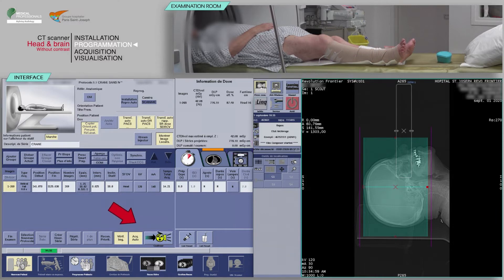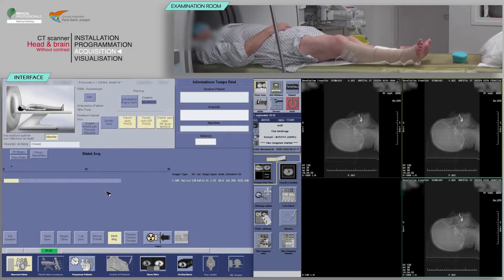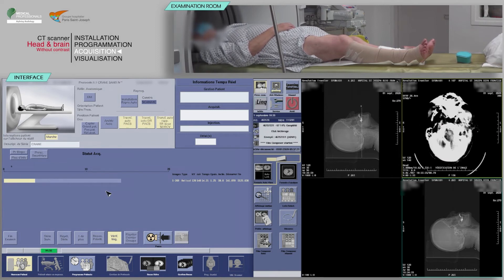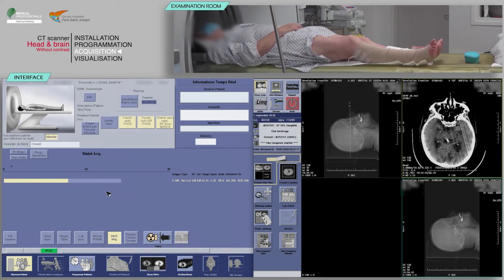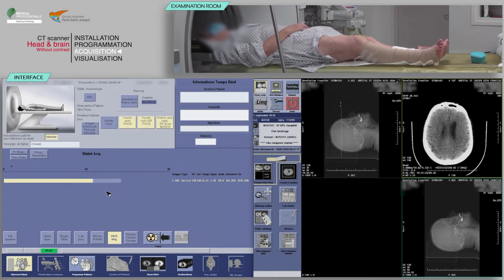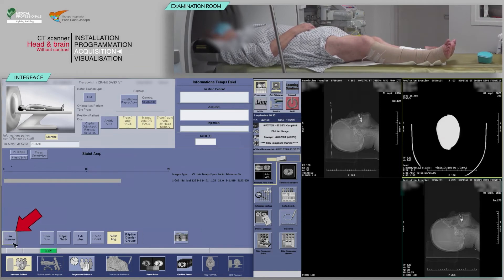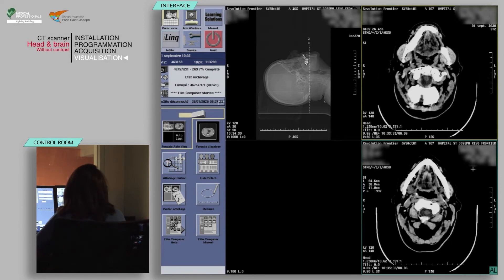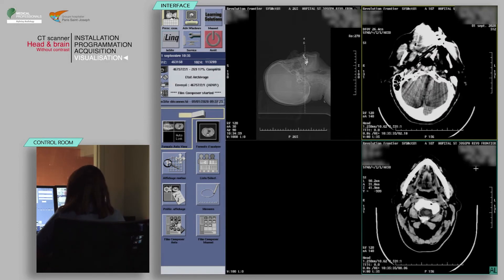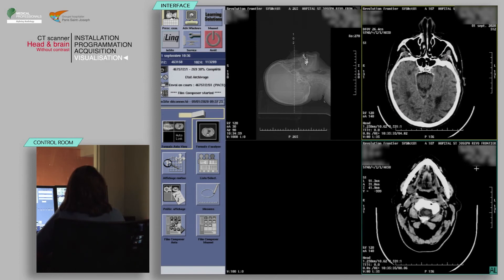Click Confirm. On the keyboard, move the table and proceed with the acquisition when the buttons are flashing. Verify the absence of patient motion on the acquisition and ensure all pertinent anatomy has been covered. Click End Exam.